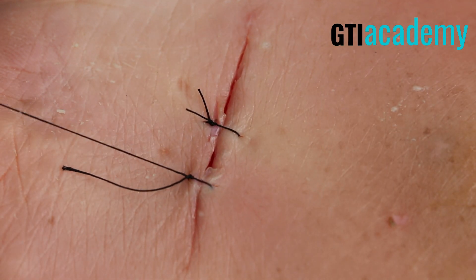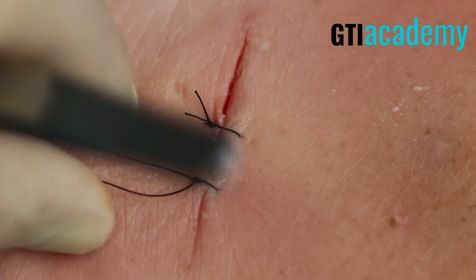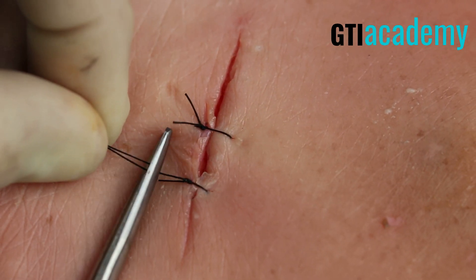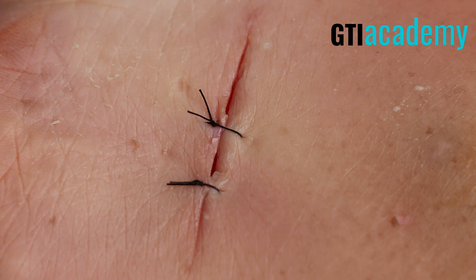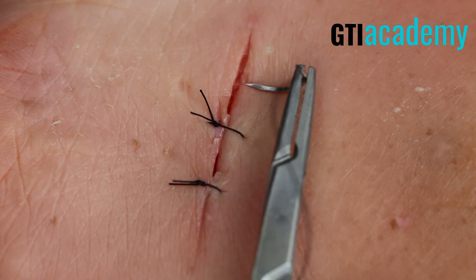We're going to repeat this for each of the wounds. Look how well the wound is approximating. Now these loose ends — when I cut the suture, I'm going to look at the previous suture and try to make it as equal as I can. This will make the sutures look more aesthetic.